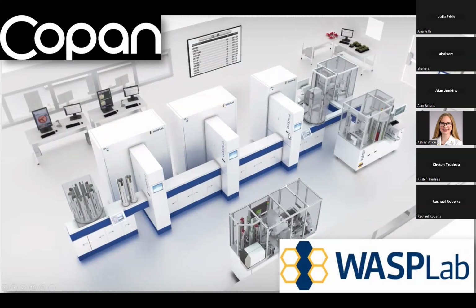It comes out and gets re-imaged at certain pre-programmed times. Notice that the readers are not on the line over here. They can be sitting all over the place, wherever. They look at the pictures and decide what to do. If they want to look at a culture, it comes out into one of these canisters. So you can collect 10 or 12 cultures at one time, pull them over to your bench, and do the workup on the cultures.